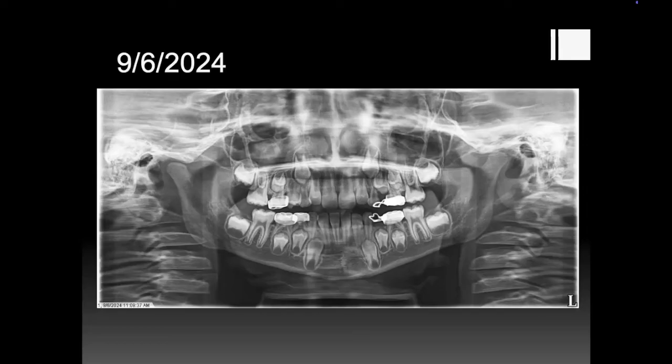And you get to this, which is almost the middle phase where I hate treating. Because you have limited anchorage, you need skeletal expansion, the child's getting older, the baby teeth are coming out, the permanent teeth aren't in yet, and at that point, most of the time, I'll pause and wait for all the permanent teeth to come in and do a traditional Hyrax or Haas type expander later, or if it's a really severe discrepancy, something like an MSE or MARPE to make sure that we get the skeletal changes. But in a case like this, in my opinion, we're at the tail end of predictable orthopedic expansion.